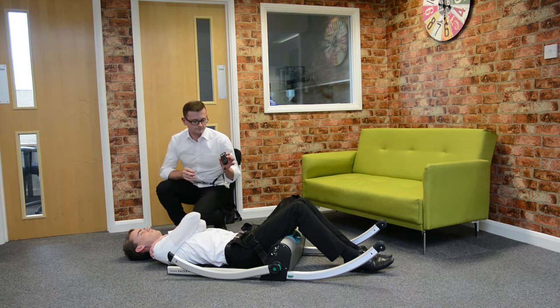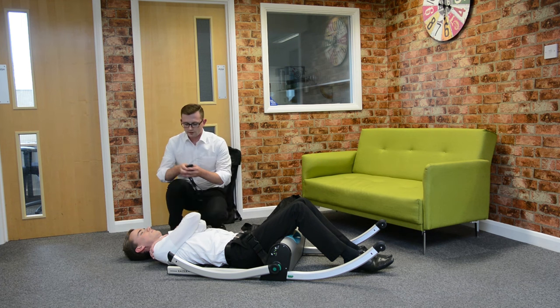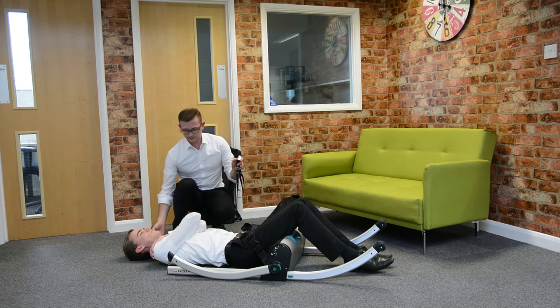Then using the remote, we can lift using the up button, or use the button on the side here. So we'll lift him, supporting his hand at the same time.